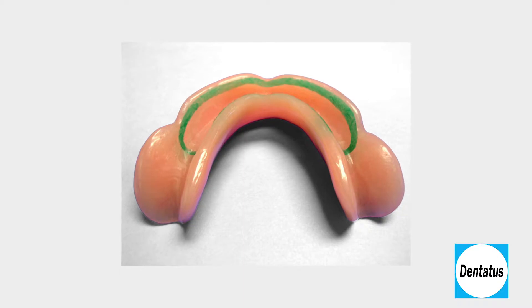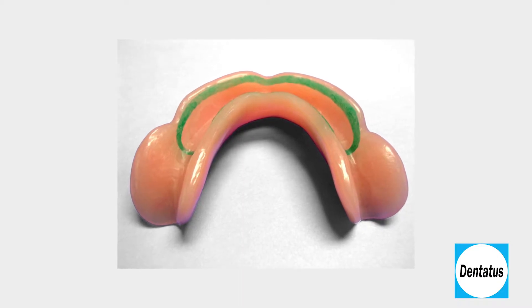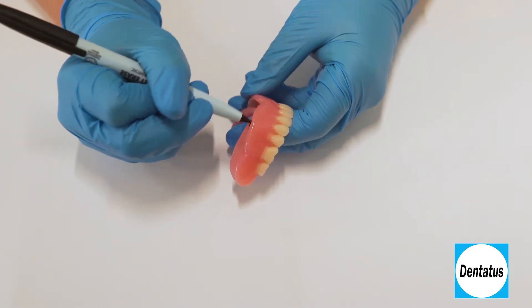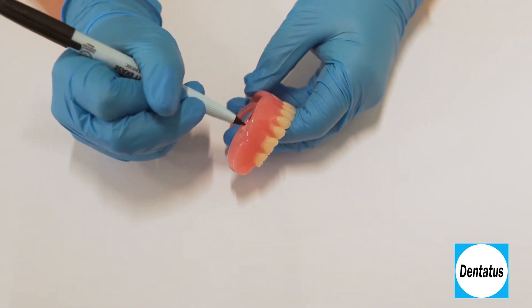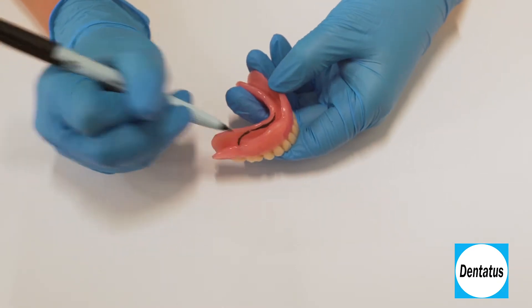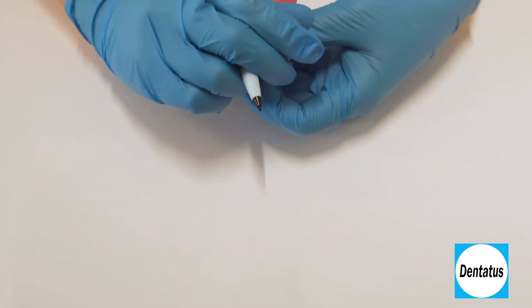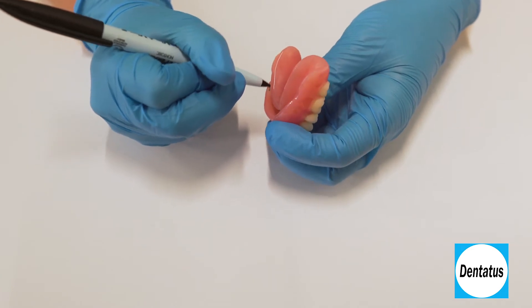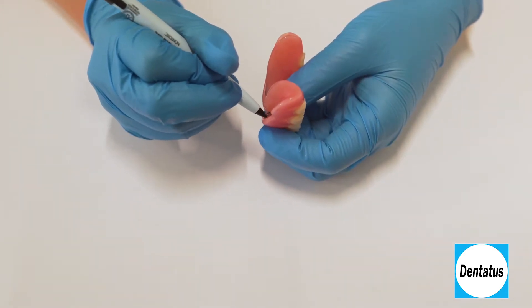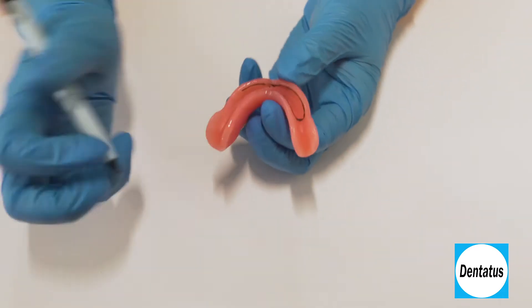To prepare the denture, a marking pen is used to delineate the areas to be relieved. Stay two millimeters from the edge of the flange and extend to the posterior just short of the retromolar pad so that you still retain a hard stop. It's best to round the extension so the liner cannot disengage on its own. Avoid sharp edges so the silicone can flow easily, which will help avoid air bubbles in the liner.